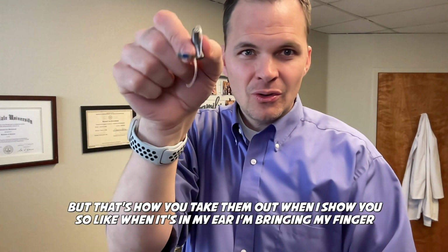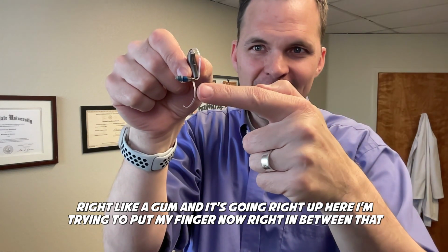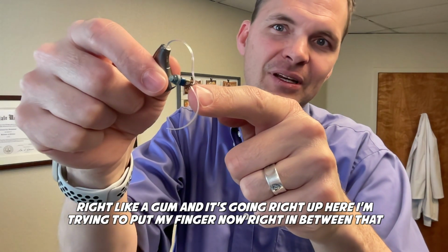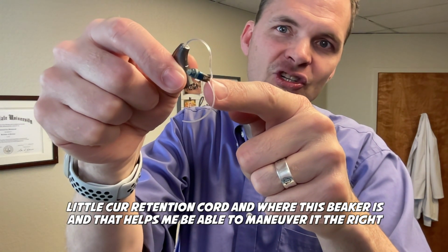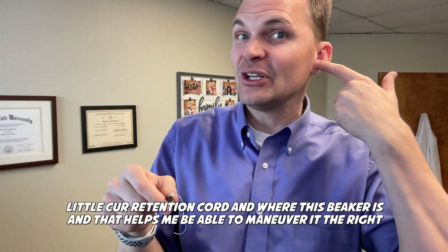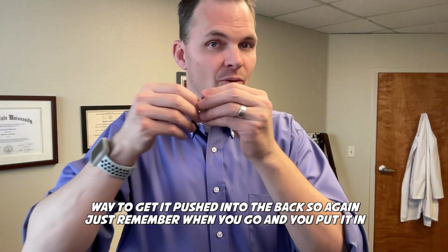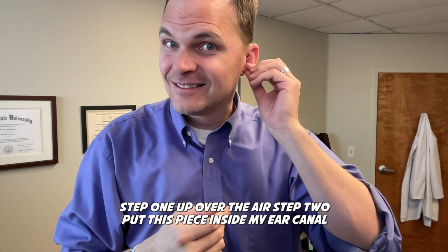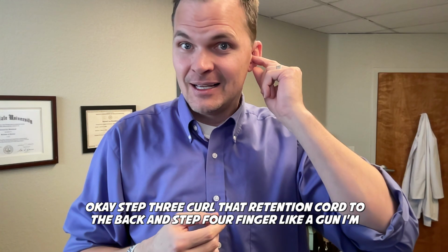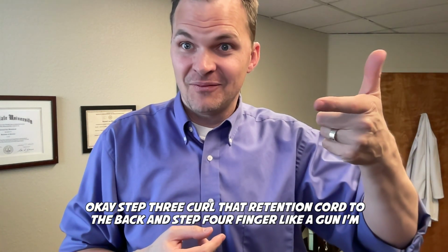When I show you, when it's in my ear, I'm bringing my finger, like a gun, right up here. I'm putting my finger right in between that little retention cord and where the speaker is. And that helps me maneuver it the right way to get it pushed into the back. So again, just remember, when you put it in: step 1, up over the ear. Step 2, put this piece inside my ear canal. Step 3, curl that retention cord to the back. And step 4, finger like a gun.